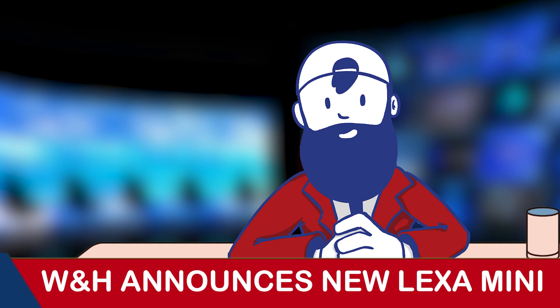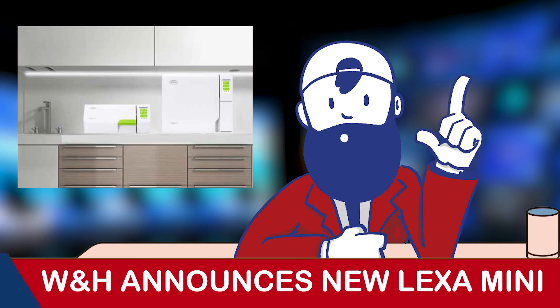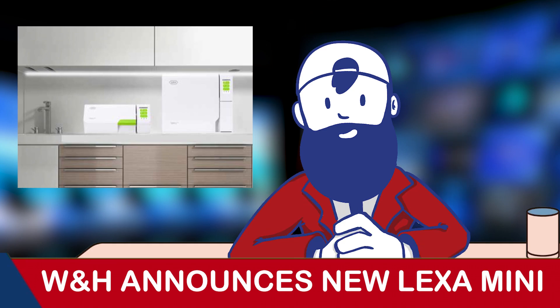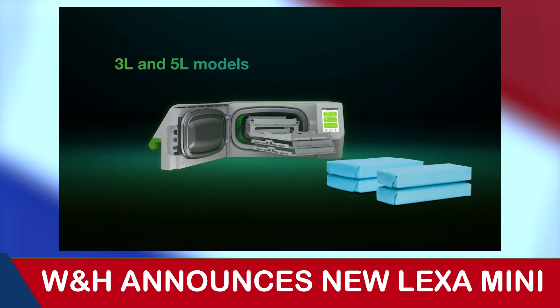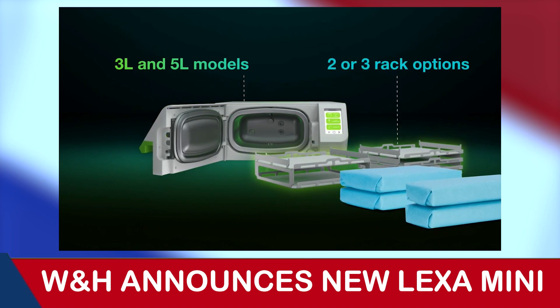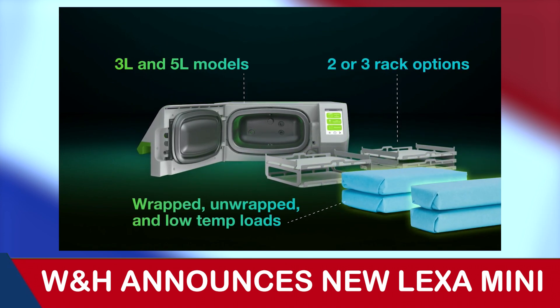The versatility doesn't stop there, as the Lexa Mini can be used not only as a standalone unit, but also as a complementary device to other tabletop sterilizers for fast sterilization. Available in two models: a three liter for two cassettes, and a five liter for four cassettes, the Mini also aims for maximum convenience.